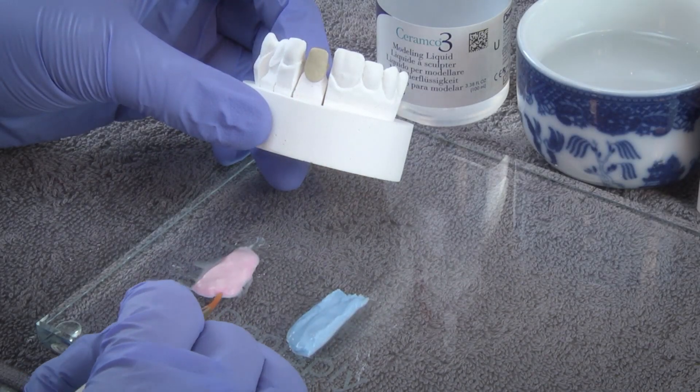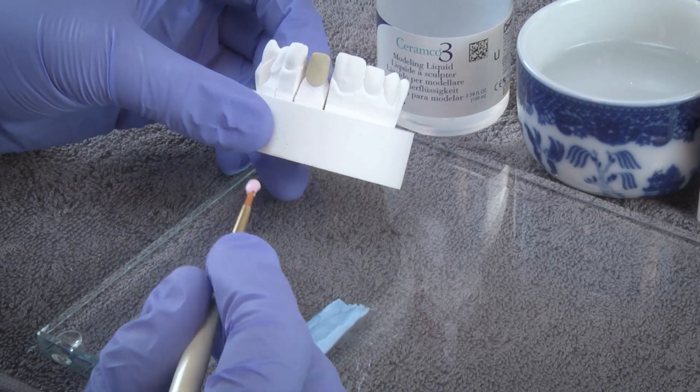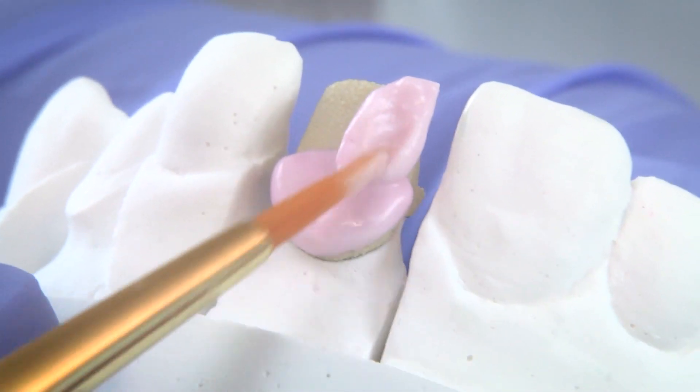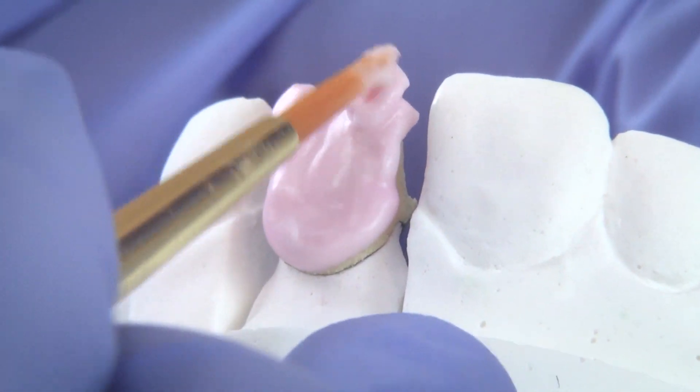I've done countless workshops around the world and have had the opportunity to meet with all kinds of technicians and see all kinds of abilities, but yet I consistently still hear about everyday problems. Ceramco 3 is a porcelain system that offers tremendous value for laboratories. The system is easy to learn and apply the concepts and delivers reliable, consistent results for metal-based PFM crowns.